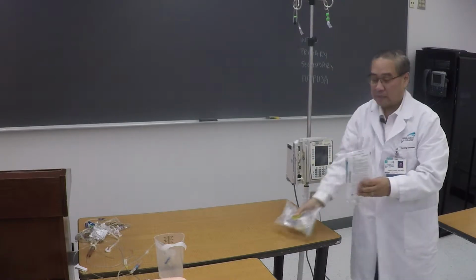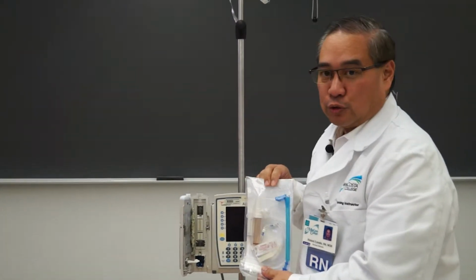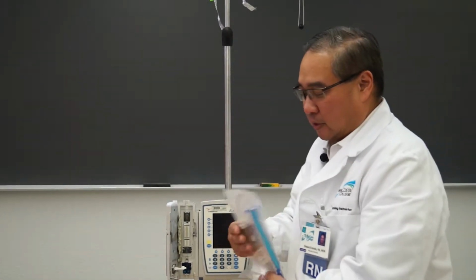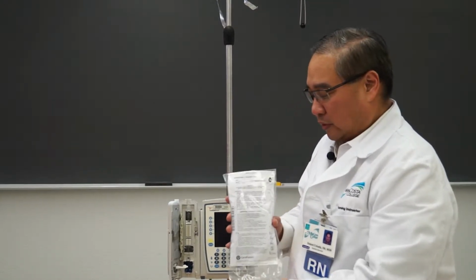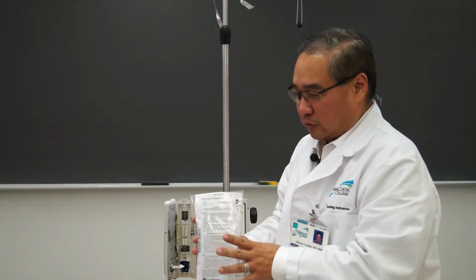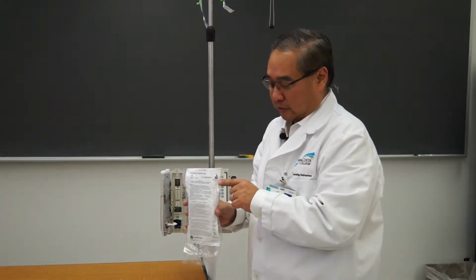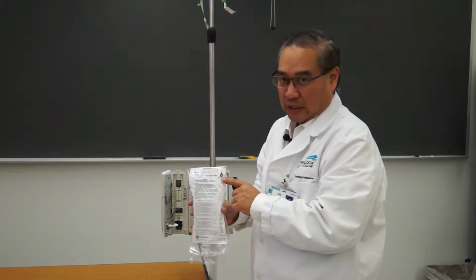Now, many times the tubing itself is specific to the branding of the pump. In this case, this is the Alaris pump, so I would need Alaris tubing. Now, one thing to remember here is that on every tubing, on the top corner there is a drop looking symbol here. And next to the drop symbol, you can see the number 20.